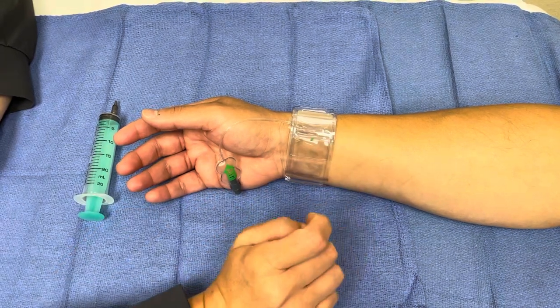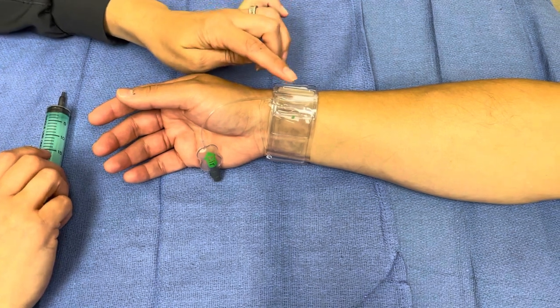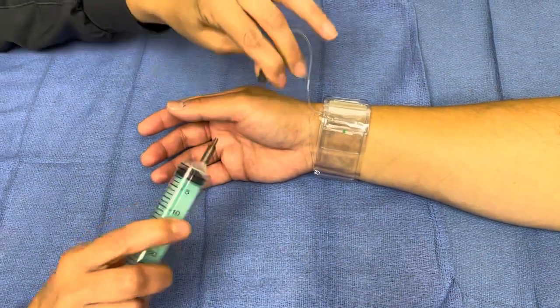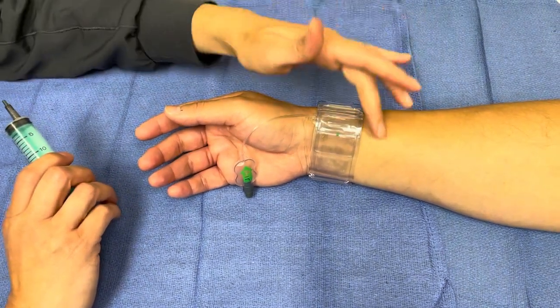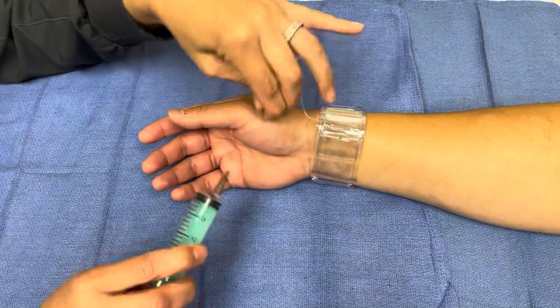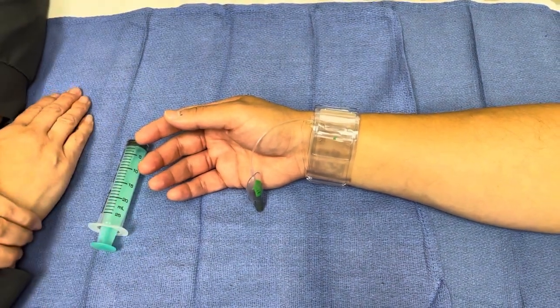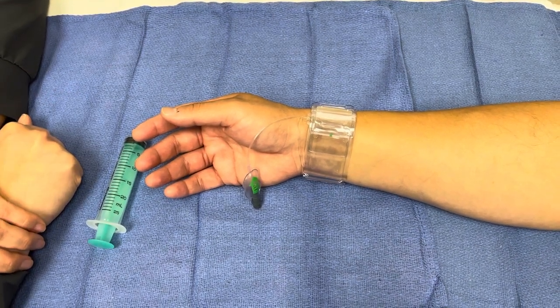If there's swelling that develops back here, that would be a hematoma, most commonly caused from overinflation of the balloon. That means there's too much air in there, and we're going to take out one cc of air from the band. We're going to mash the hematoma out and watch it. If it regrows, we're going to take one more cc of air out of the band, mash the hematoma out, and watch it. If it does not regrow, we're going to leave it alone for the next 15 minutes, then start the process of removing two to three mils of air after that.